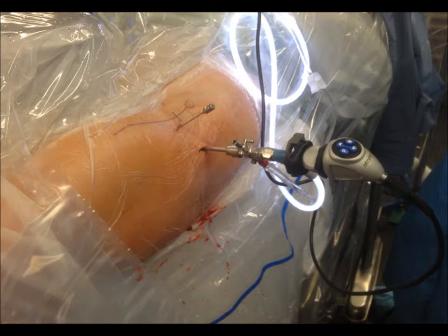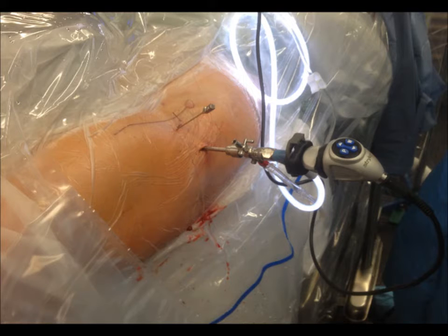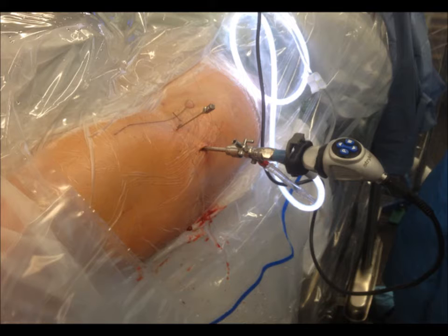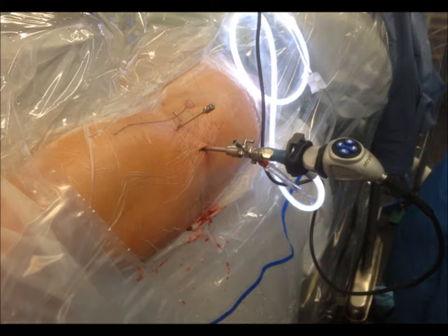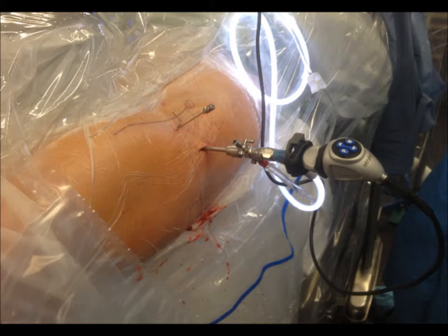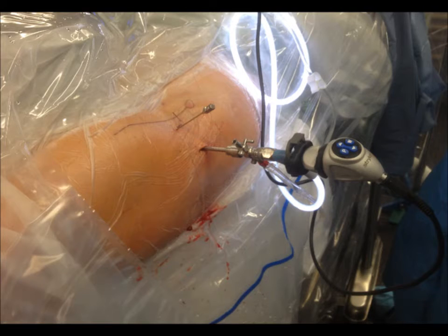Typically, three portals are used for this procedure: the anterior lateral portal, the mid-anterior portal, and the accessory anterior lateral portal, which is approximately 4 centimeters distal to the anterior lateral portal. These portals are created in standard fashion using cannulated instruments, which include spinal needle, guide wire, and trocars.